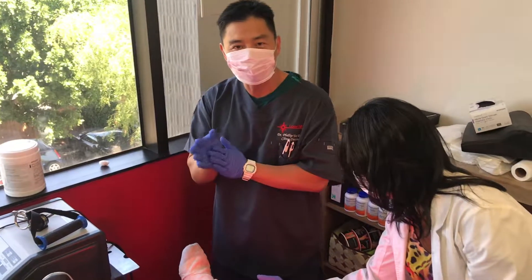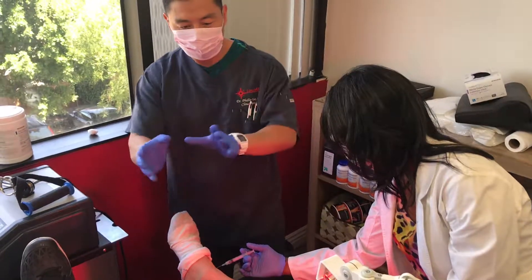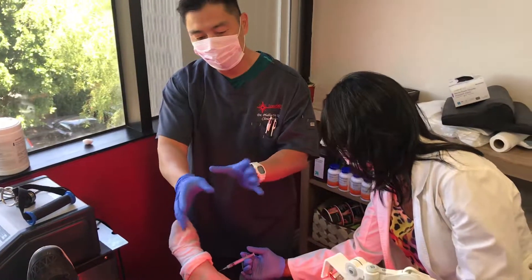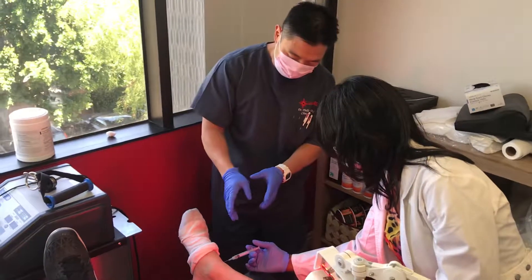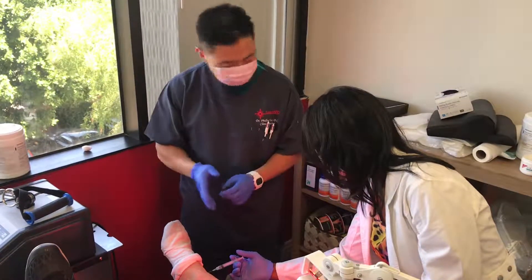I'm Dr. Philip B of the 21st Century Regenerative Medicine Institute. Today we're working on — we saw how he worked on John's medial knee procedure — now we're doing a lateral ankle laser-guided umbilical cord stem cell grafting.